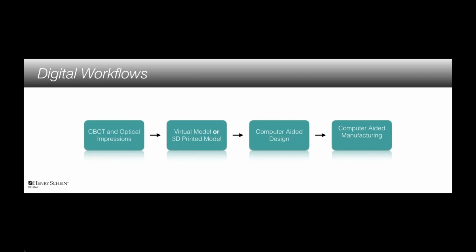It's acquiring data in the digital world and then utilizing that data, putting it into software, putting it into programs, going into design or planning scenarios so that we're able to then use the data. And when we use the data, we can then go into manufacturing. We can look at how do we create definitive restorations, or how do we plan provisionalization, or how do we design the smile, how do we really diagnose and treatment plan, and then ultimately how do we go into manufacturing all throughout that digital workflow and being able to get predictable outcomes.